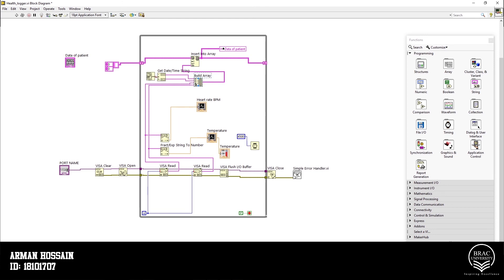Now we need to fill our data table. That's why we use build array here. It will create an array of string of our data. Then it will be inserted to array. This whole process will be in a while loop and will be repeated every 4.5 seconds.